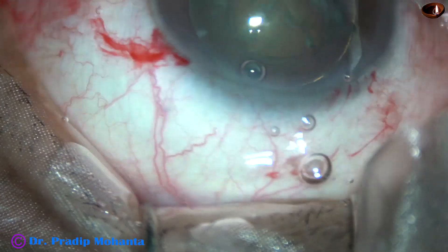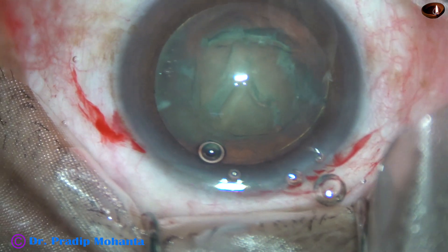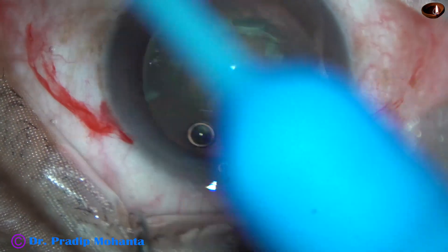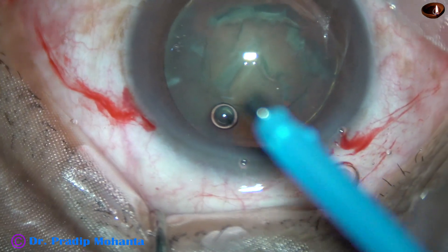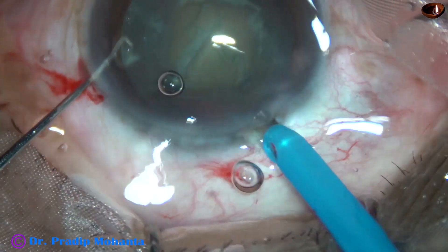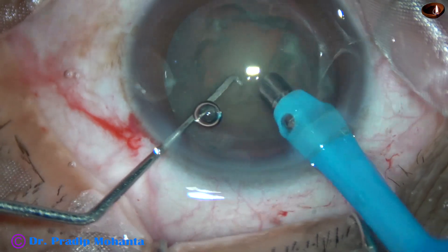Visco again fills the anterior chamber, and now the tip of the feco needle is introduced. The machine being used is Faros from Oertly. The tip of the feco needle enters into the anterior chamber beveled down.